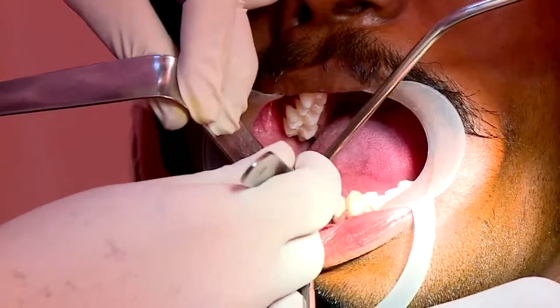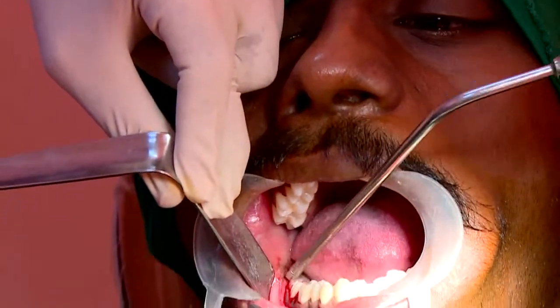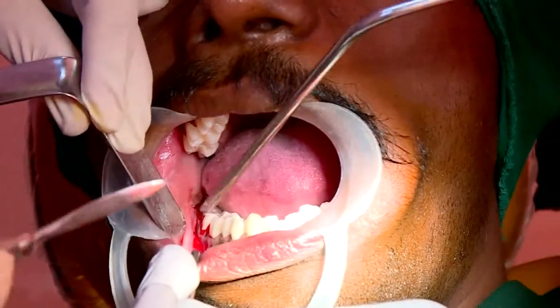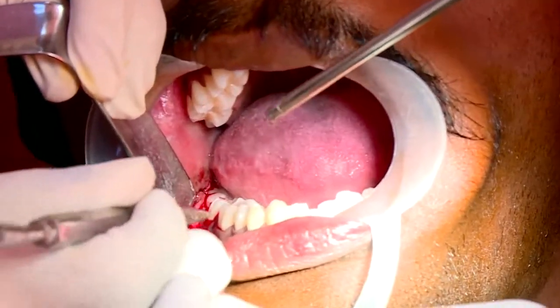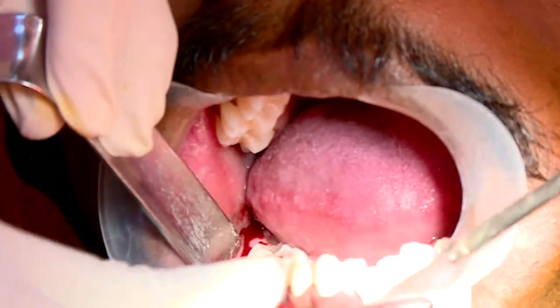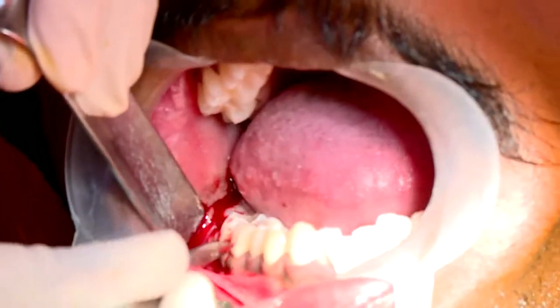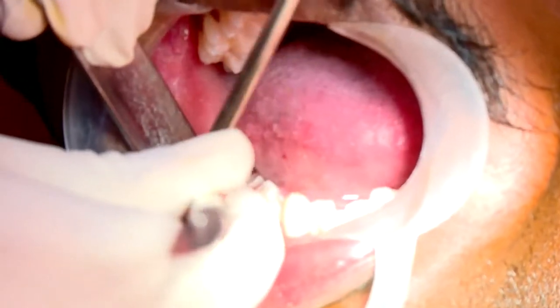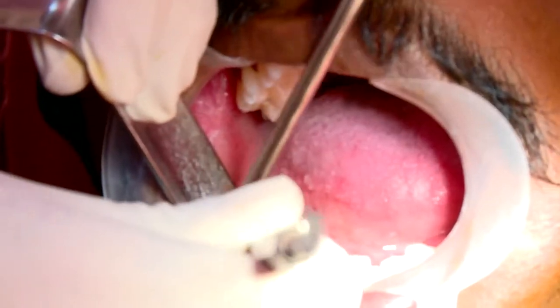Then you make the incision through the sulcus. You do not split the papilla, you respect the entire papilla, and you make the distal releasing incision through the ascending ramus. The incision should go up. The distal incision should be for 2 to 3 millimeters in bone. You clean the bone distal to the second molar, or what is exposed distal to the third molar, and go along the ascending ramus of the mandible.